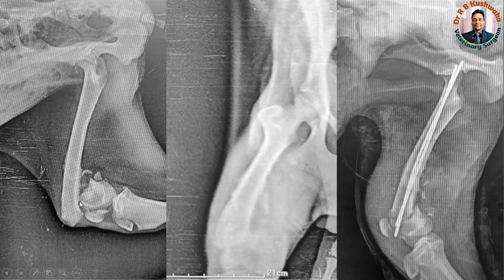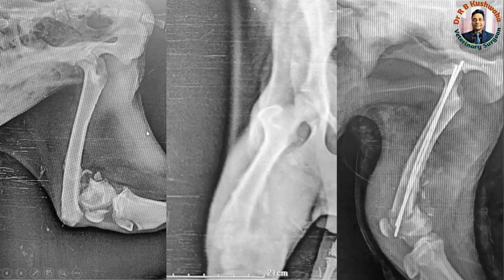If you have a 2.2 or 2.5 mm K-wire, you can manage this fracture by dynamic cross pinning. This is the craniocaudal view of the supracondylar fracture — you can see the very small distal segment and the proximal fracture segment.